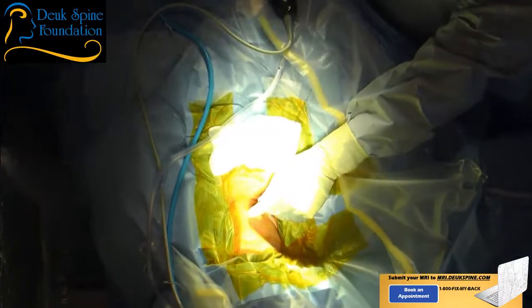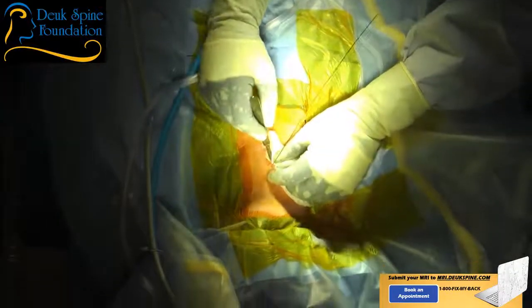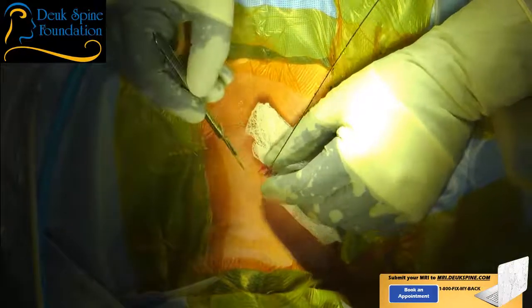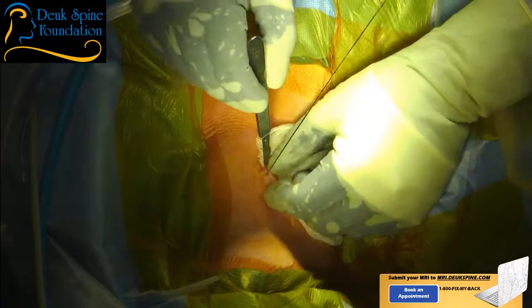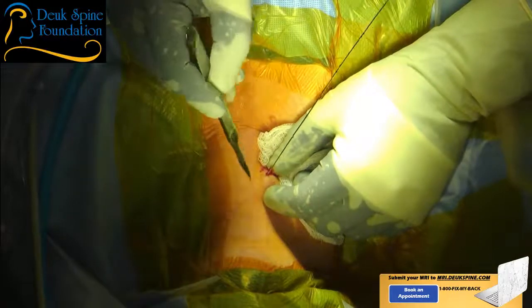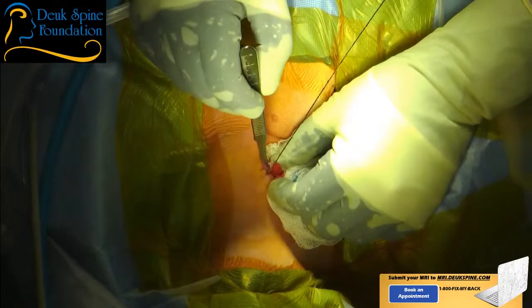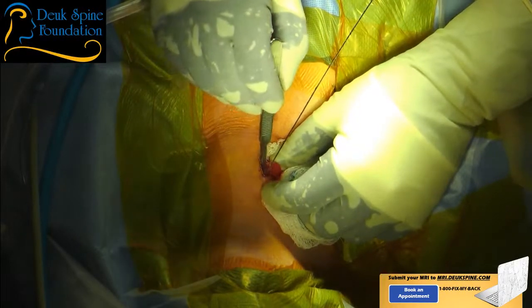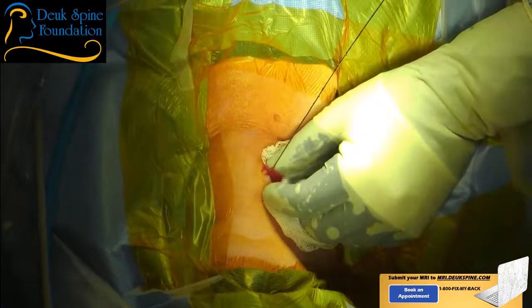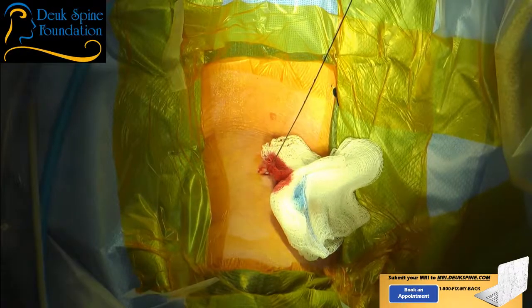There's epi in there. I'd say 1 mil injected. The rest of it came out. So our incision is 1 millimeter, sorry. I'm sorry, it's 4 millimeters. The incision in the skin is 4 millimeters. It's very small, so it heals very quickly. I may have to make it a little bigger. It's kind of hard to tell exactly if it's large enough.